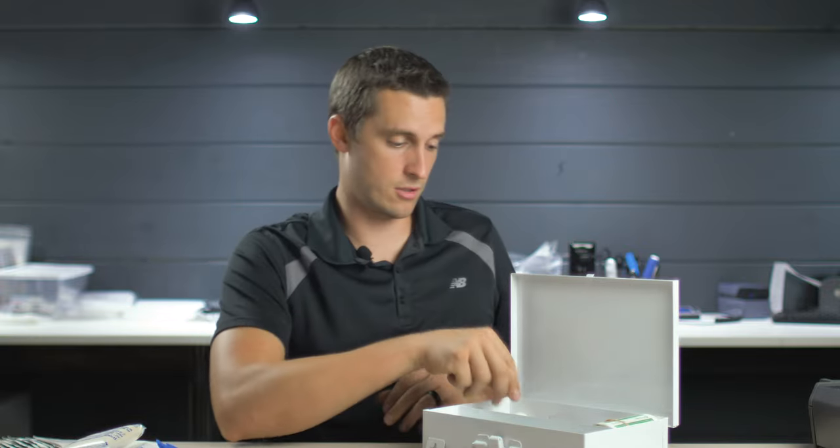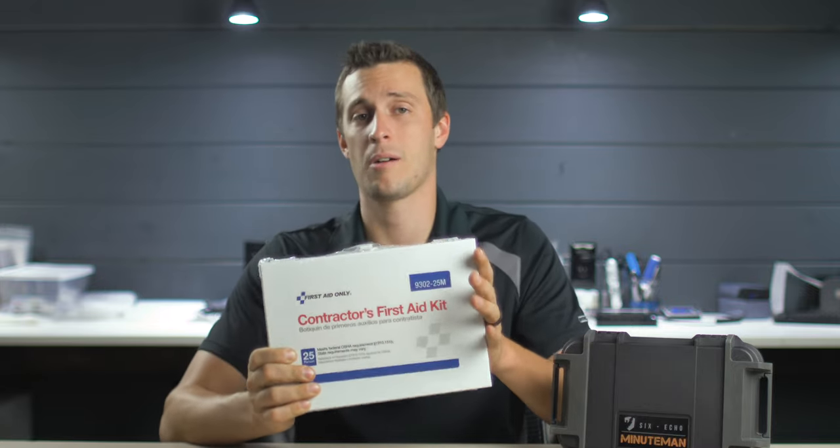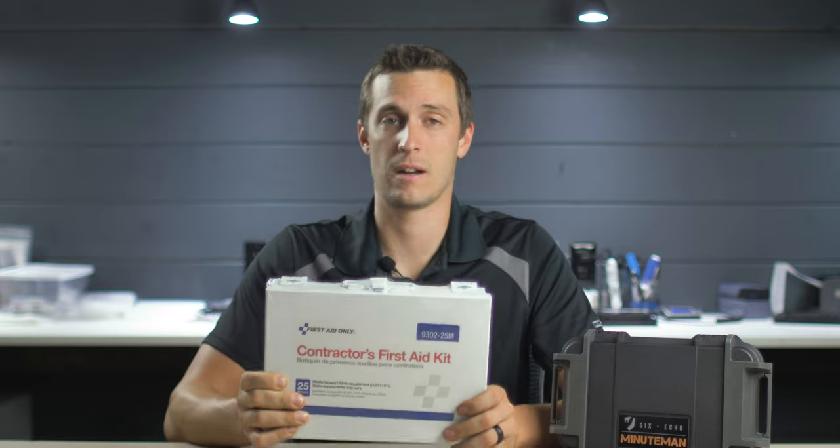They said this kit came with trauma shears. So most of this kit that they are saying — look at all the stuff we have in this kit — most of it's just band-aids that you can buy cheaper somewhere else. I bought this contractor's first aid kit off Amazon. We're going to open it up and see how it compares to some other first aid kits out there on the market.